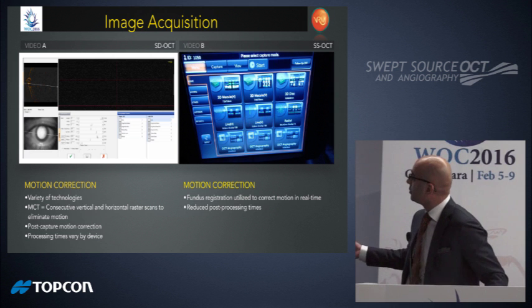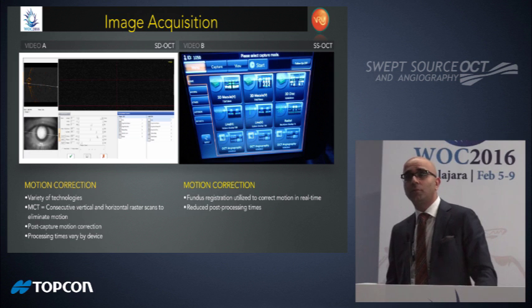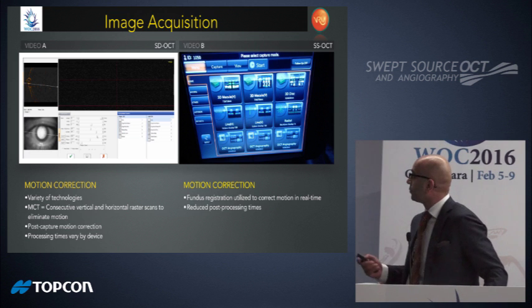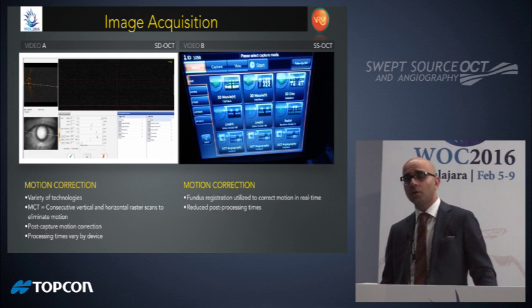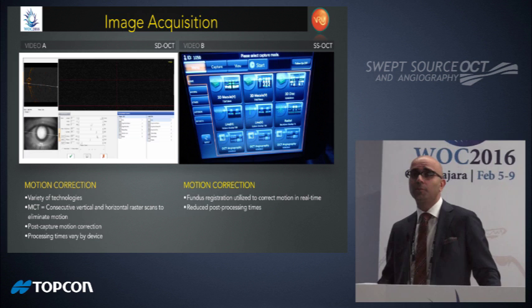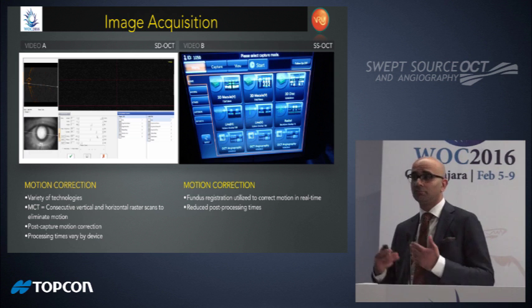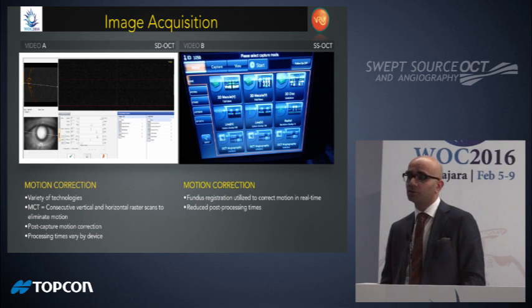So video A on the far left is of a patient having a spectral domain OCT performed. The first step here is to acquire a horizontal line scan with one of the competing devices. Then the patient will obtain a 3 by 3 millimeter OCT angiography image. So we can see off the bat that the machine has a unique way of acquiring the image. Focusing is required before the acquisition of the image.